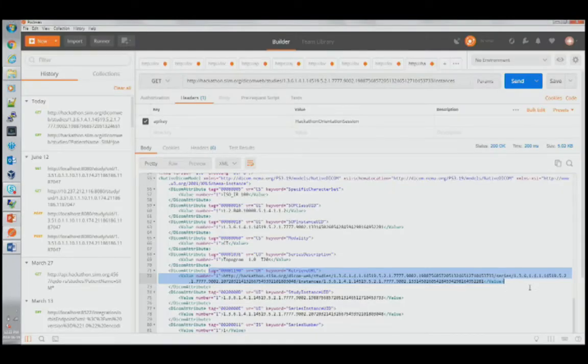Yeah, thank you. We also have series numbers and instance numbers. I'm not going to actually highlight them here, but again, just ways of structuring data. Because, for example, if you talk to radiologists, you'll usually hear radiologists talk about something like a hanging protocol. When they used to have film, they used to have literally a way of hanging those films side by side. So similar thing when you have a viewer. If you have a DICOM image viewer, they don't just put all the images on the screen and explode them, right? This is not your family photo album. These are medical images, so there's hanging protocol. So you have to look at all these little clues within the images to decide how to lay them out for the radiologist or the user to see.